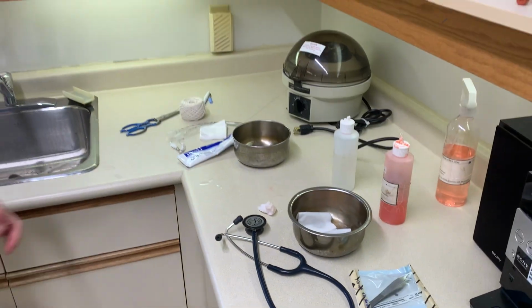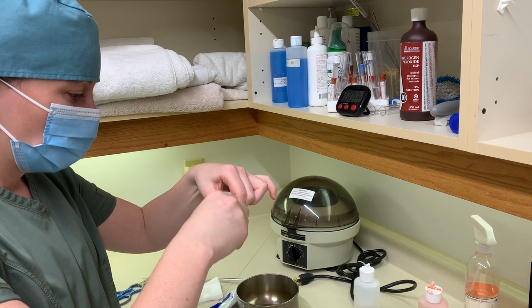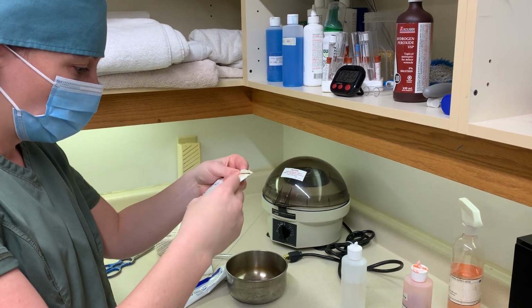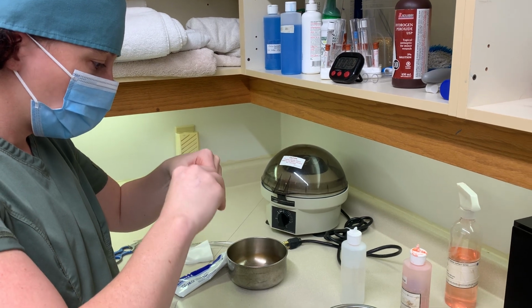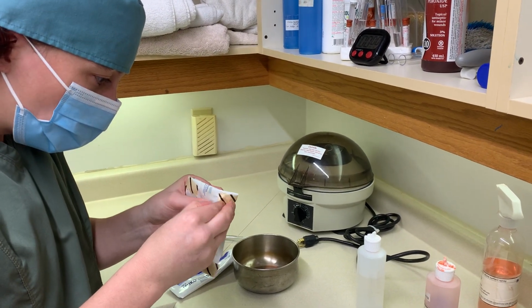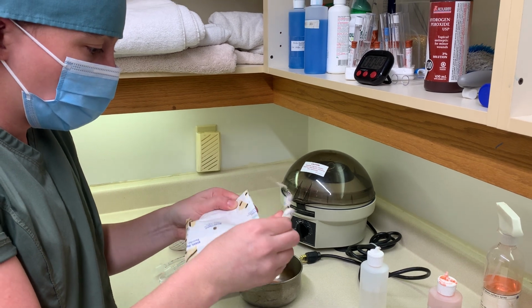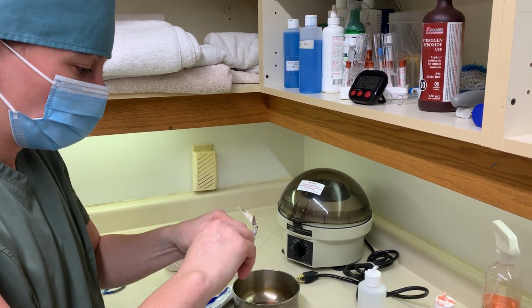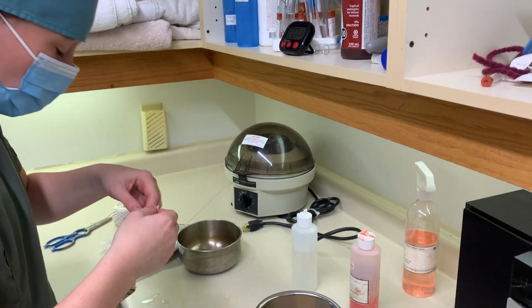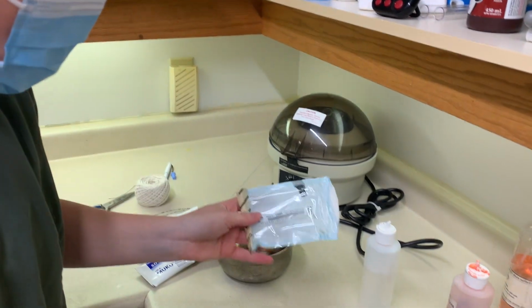And now I'm going to start by opening my sterile forceps. This all looks fine. It's ready to use. I've got the date on here and my name, so that's great. And I'm opening them in the direction of the handle. Tape's just a little bit hard to come off here. Okay, we're getting the tape here now. Good. So then we can pull up on this, just like this. Good. And then we can see that the indicator has changed color, and I just made a hole while ripping the tape off, so that is fine.